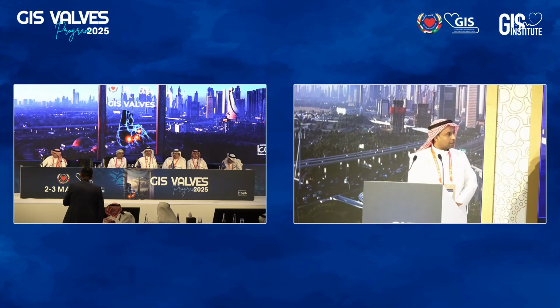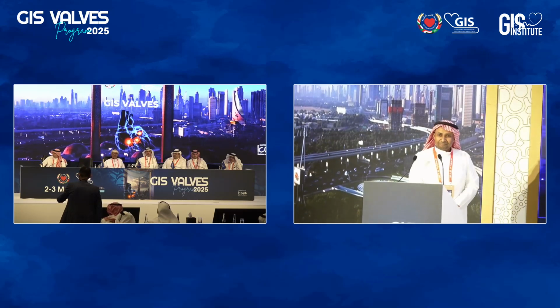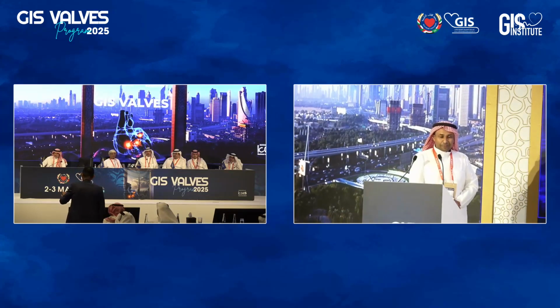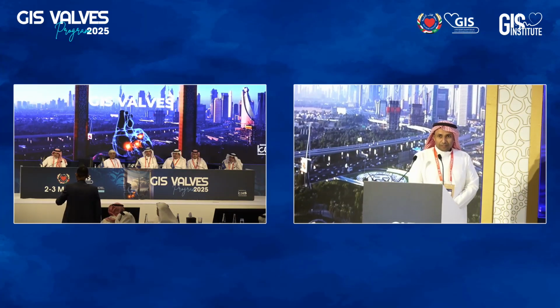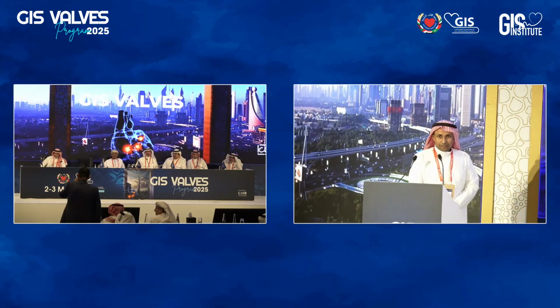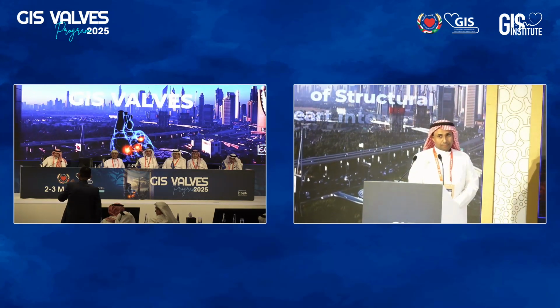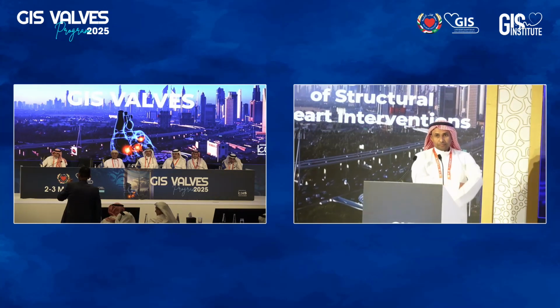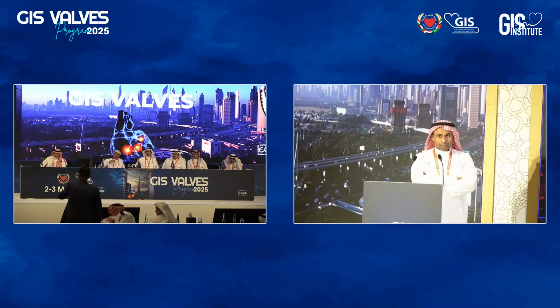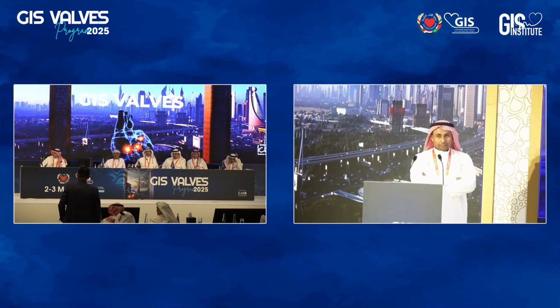Okay. Great case. Wonderfully managed, to be honest. Going to the room and sending the patient to the surgeon is not an easy decision. I skip a beat every time going to the patient room. That's really brave and very nicely done by you. One thing, I think that the coplanar view was the problem for the whole thing. The non-coronary cusp was very high, and you were targeting it, and it was actually very low, and you were not in a very good view. I think that was the problem that created the whole problem.